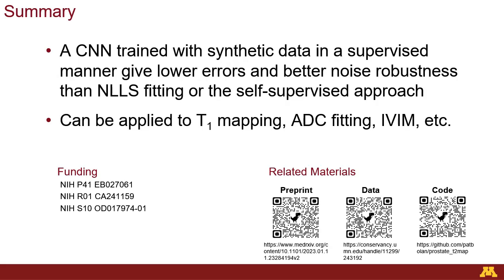In summary, we showed that a CNN trained with synthetic data in a supervised manner can give lower errors and better noise robustness than nonlinear least squares fitting or the self-supervised approach. And we think this method can be applied to many other quantitative MR techniques.